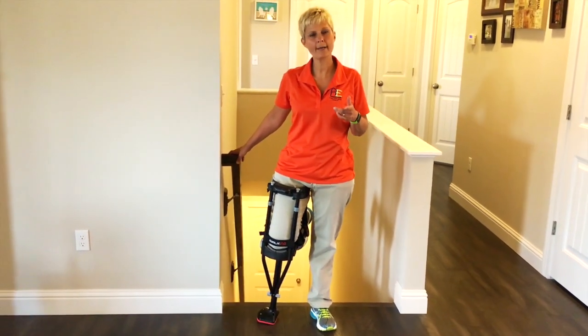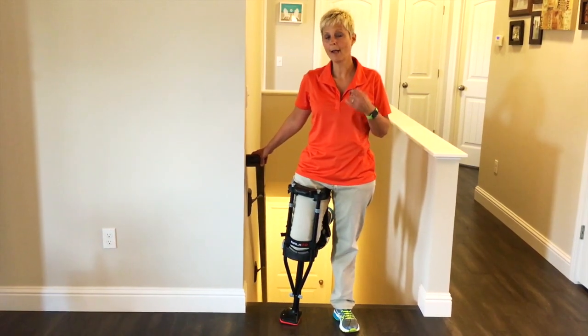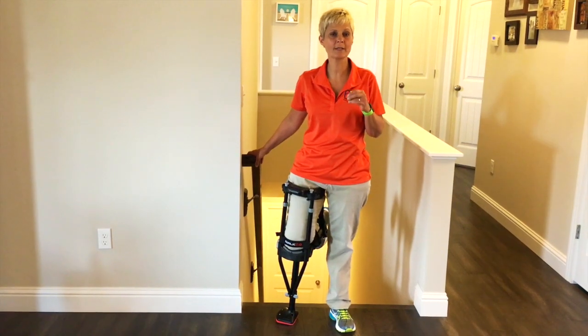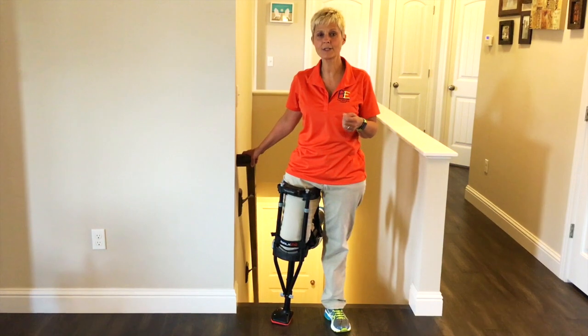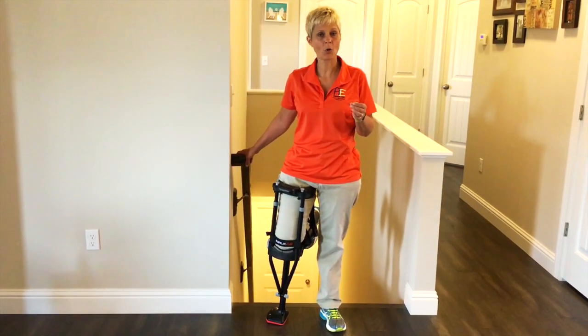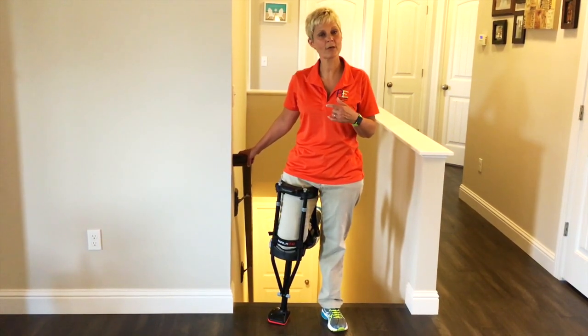Now I have tried a couple of steps without anything to hold on to with the iWalk. I don't feel real comfortable with that. So if you have a couple of steps that you're going to be contending with and you're going to try to use the iWalk, I would suggest at least having a cane for those steps just for a little bit more balance. So that's what we can do as far as using the iWalk 2.0 on stairs with railings on either side.